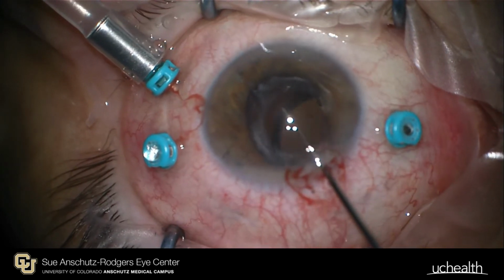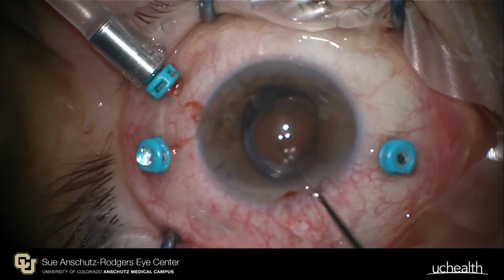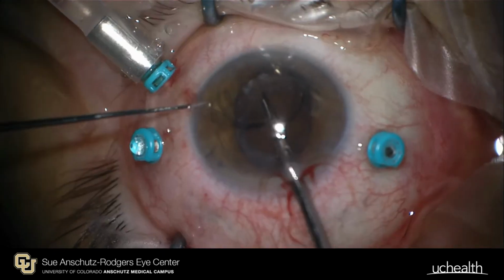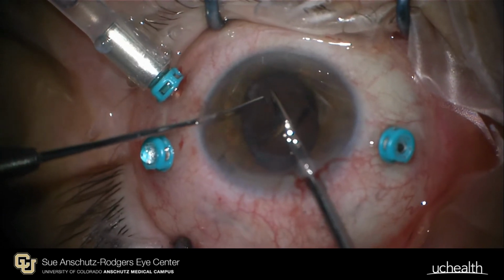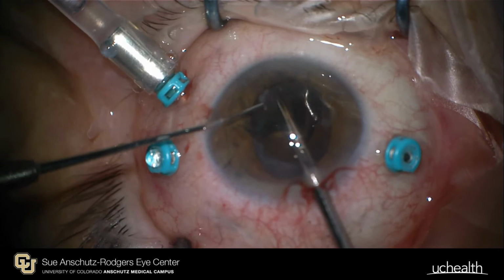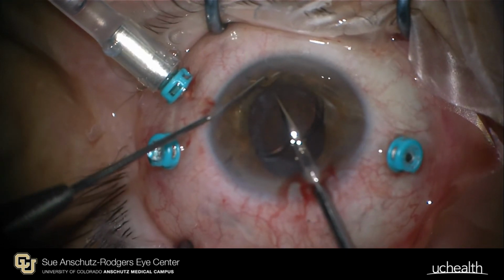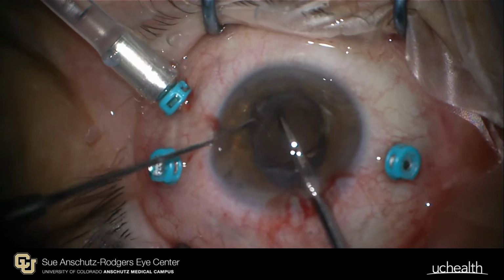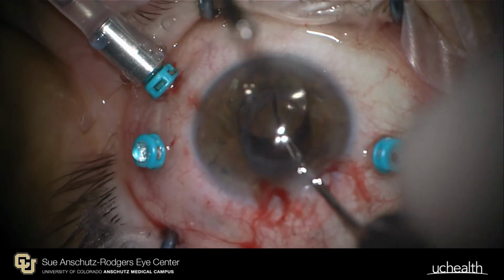This previous lens surgery was done at an outside hospital with no available records, and the presence of a CTR was not previously noted. Initially, the light pipe was used to push the lens and the capsular bag into the AC. However, there was significant immobility of the lens in the capsule. The lens was then rotated as shown into the AC, cut, and removed through the clear corneal incision.